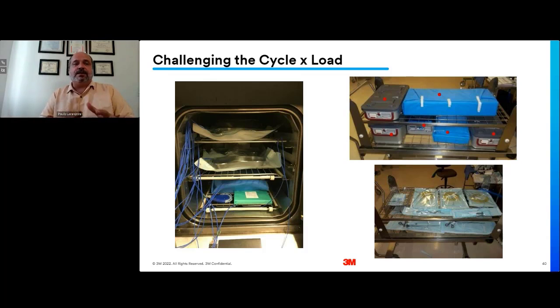And I'm saying this because I normally hear users saying, well, everything approved, all my CIs, everything that I had in my load showed approved, the PCD showed approved, but this one failed. So I guess the type 5 in this one here was defective. It wasn't. It was telling you that that container had a problem, okay? So this is how I should use my PCDs in reference to my load and the CIs inside of my load.